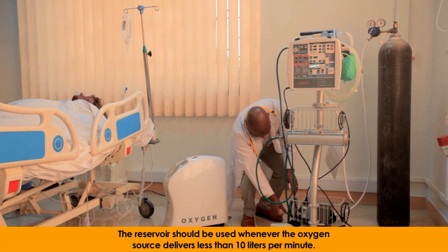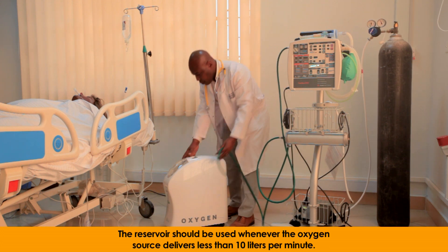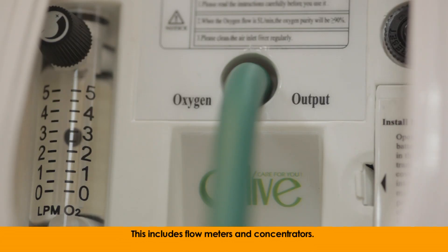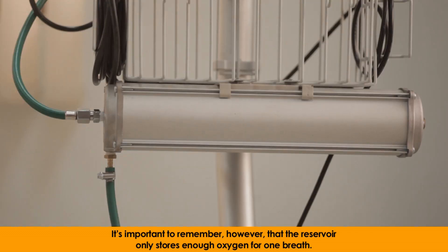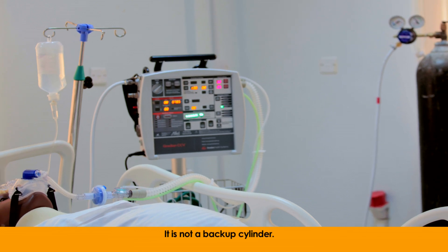The reservoir should be used whenever the oxygen source delivers less than 10 liters per minute. This includes flow meters and concentrators. It's important to remember, however, that the reservoir only stores enough oxygen for one breath. It is not a backup cylinder.